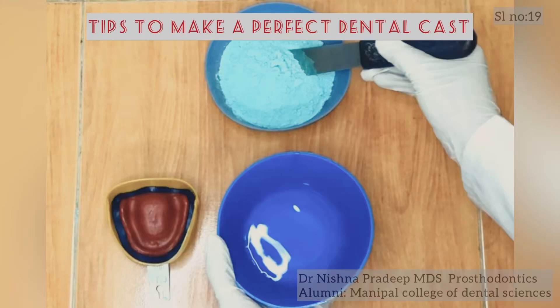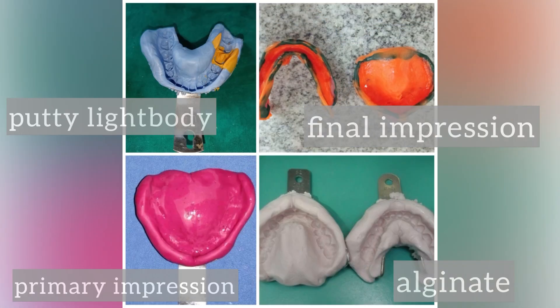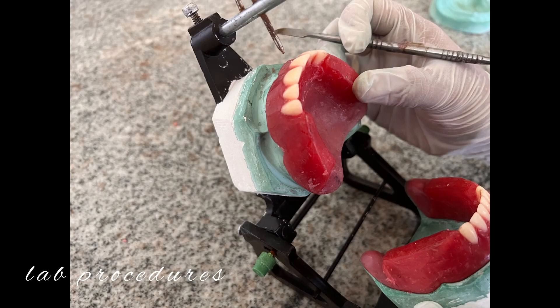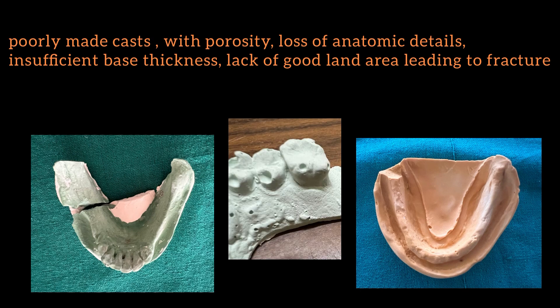Here are some tips to make a perfect dental cast. A good dental cast ensures that you do not lose any details captured during impression procedures, and it also makes the cast durable and fracture resistant during subsequent clinical and laboratory procedures. Here we can see some poorly made casts with porosity, loss of anatomic details, insufficient base thickness.